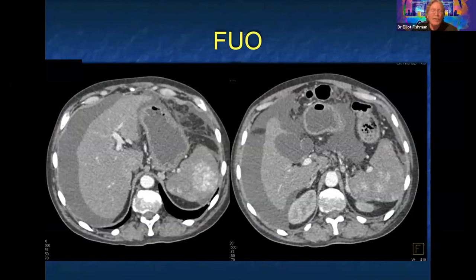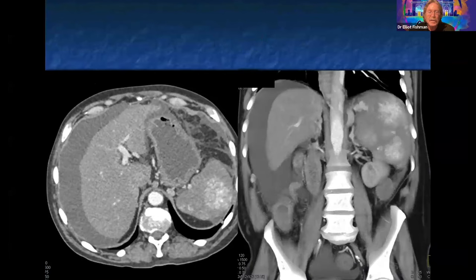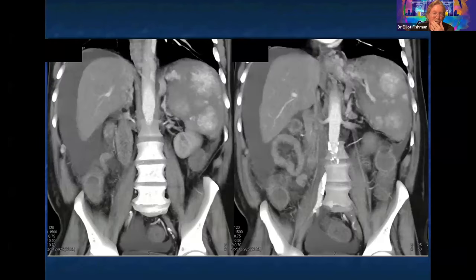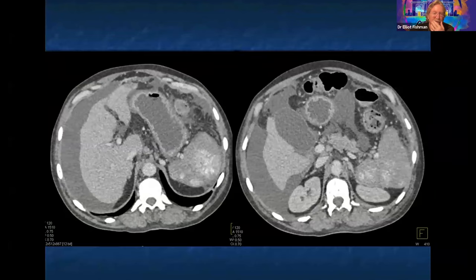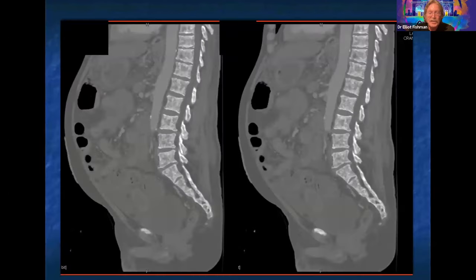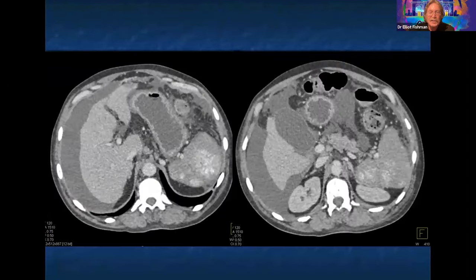These are the routine cases Linda and I see every day. Patient presents: 50-ish year old male with FUO. Look at the spleen — there were no calcifications in the spleen on the non-contrast scan. Here's some 3D showing of the spleen with extensive ascites, and here's the venous phase. You see sclerotic bone lesions and this vascular lesion in the spleen. You can get hemangiomas that are vascular, but this is diffusely vascular — you have ascites and widespread blastic bone lesions.